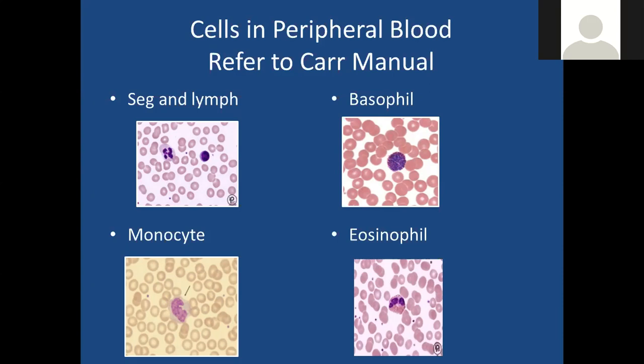But that's a basophil versus our eosinophil. It also has a segmented nucleus, often bilobed. So this eosinophil often has only 2 lobes. It has those very orange granules, very distinct. You'll know an eosinophil when you see it. It'll jump out at you, those orange granules. And then here's our monocyte. That picture is horrible, but it has a very lacy chromatin and very grayish cytoplasm.